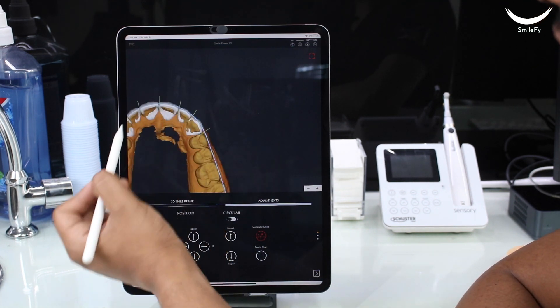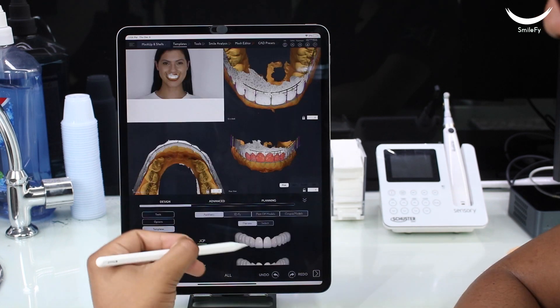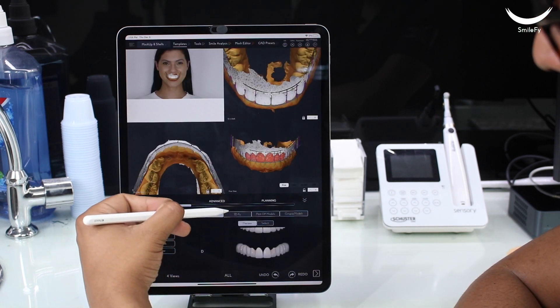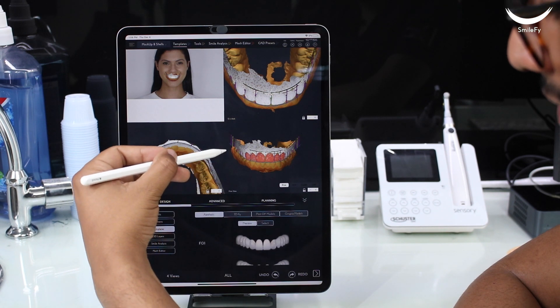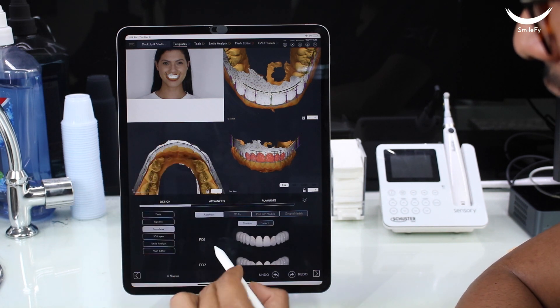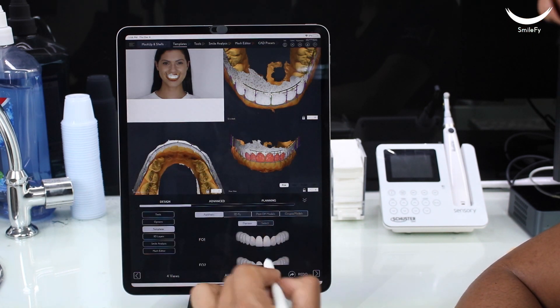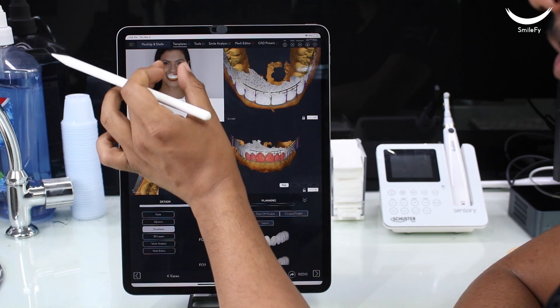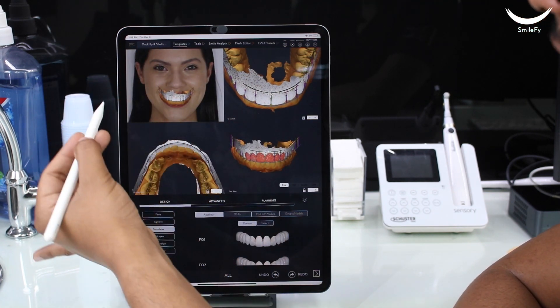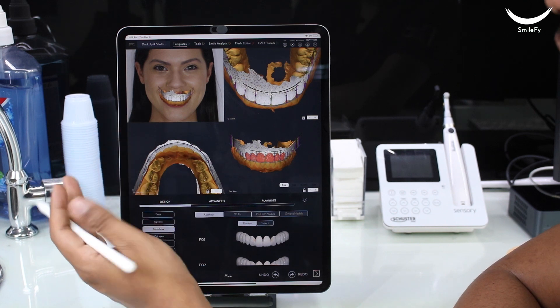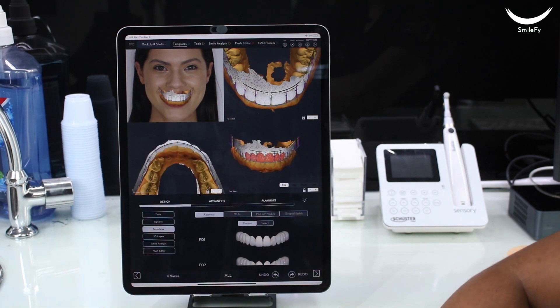To fine-tune the Smile Trial, Smilefy offers a variety of GIF templates. Once you tap on one, it will automatically apply over the patient's photograph, allowing you to create multiple versions prior to 3D printing.